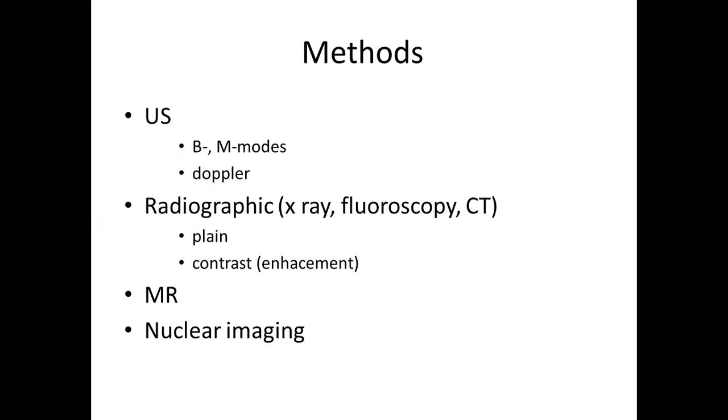And the last, but never the least important one, is nuclear imaging. Nuclear imaging is a technique which helps us understand primarily function and subsequently morphology. We have some variations, for example, scintigraphy, when we are assessing the dynamic uptake of radiopharmaceuticals, or we can use combinations such as PET CT or PET MRI.